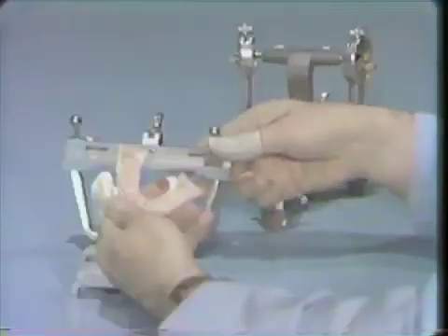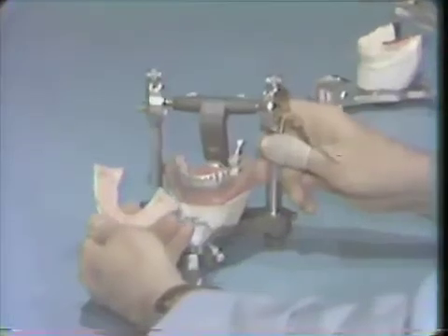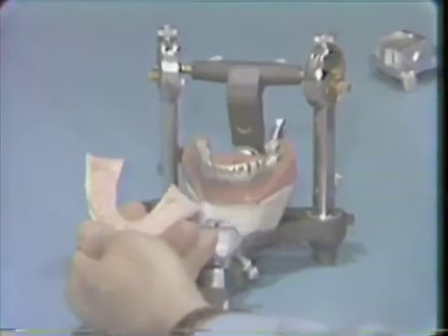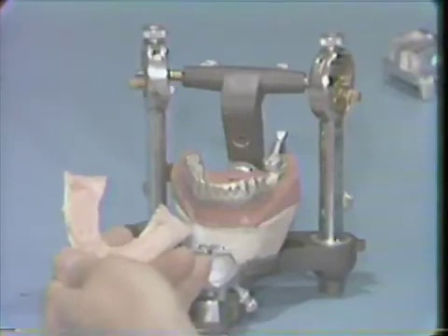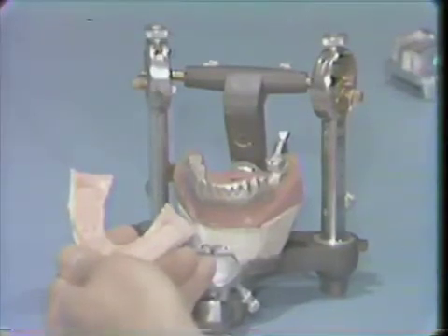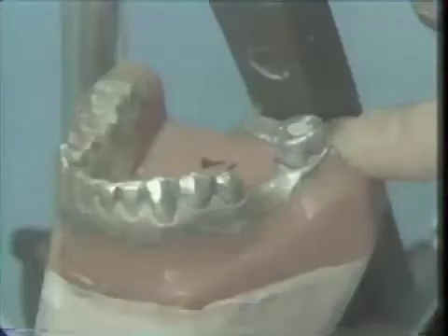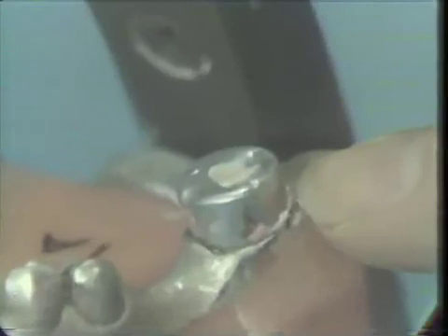So now we will transfer this stone key over onto an articulator, and in this instance we're using a Hanau Model H. Really the only prerequisite for an articulator is that it be able to reposition the centric positioning, and also have some type of a quick interchange between the stone functional key and the anatomic model. We've placed our aluminum shell crown on the molar that we took previously, and this we will use to establish our interocclusal relationship.